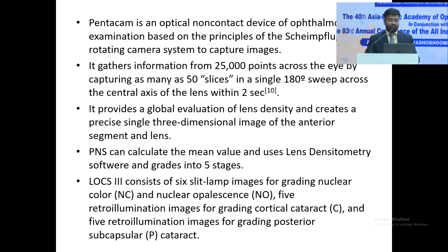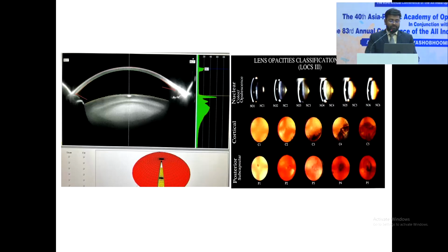The Pentacam is a non-contact device, so we can image three-dimensional images in just a second, and three-dimensional images of the anterior segment and lens are captured. It is based on the Scheimpflug imaging system. So here we have the Pentacam and the LOCS III system.